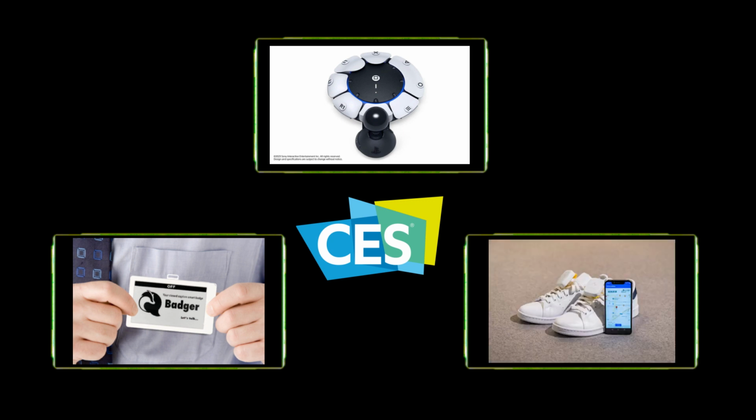And finally, hopefully I'm pronouncing this properly, is Ashira's. Ashira's Inc. is developing an in-shoe navigation system to support visually impaired individuals with walking. This is a 2-part system that consists of an app and a wearable vibrating device connected via Bluetooth. Once connected, the app sends vibrating signals to the devices attached to the user's shoe.